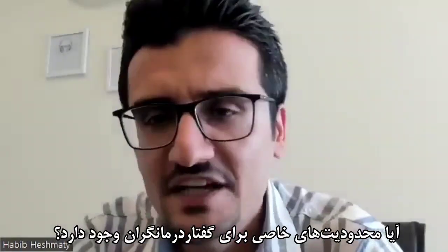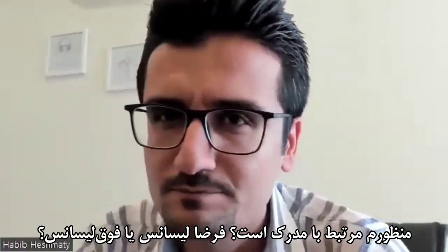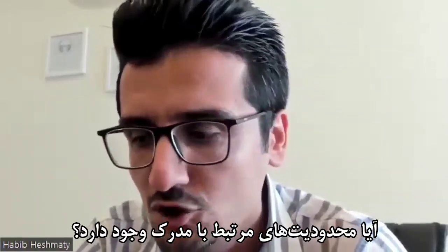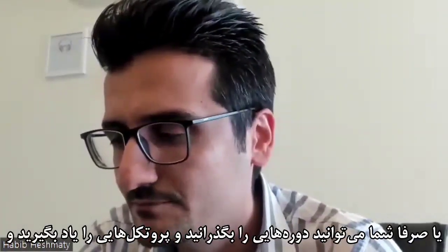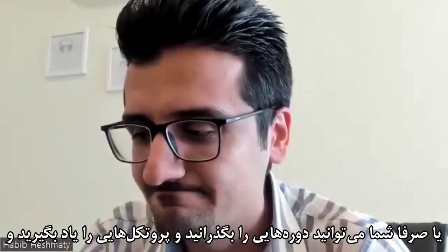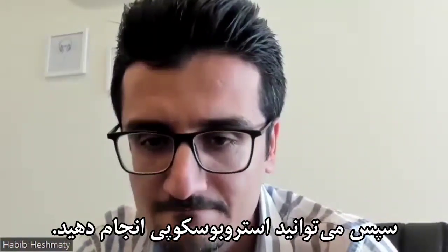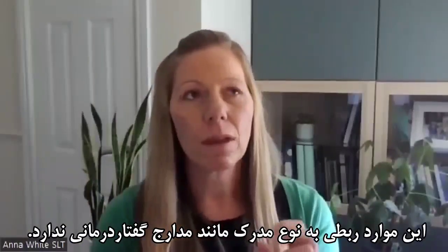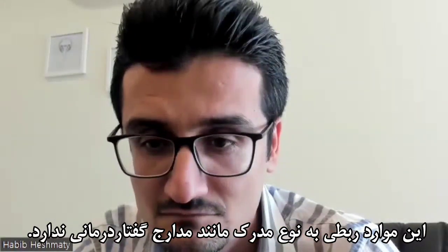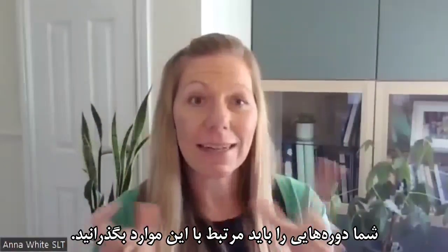Are there any limitations for SLPs, for BSc or MSc, or can you just pass some courses or protocols to do stroboscopy? It's not a sort of degree like the speech and language therapy degree, but there will be organized courses aligned with the Royal College.